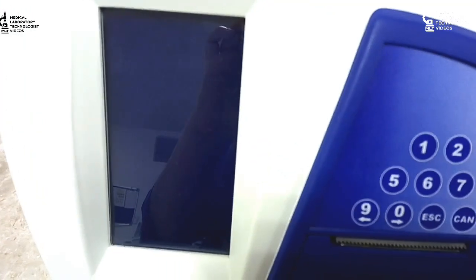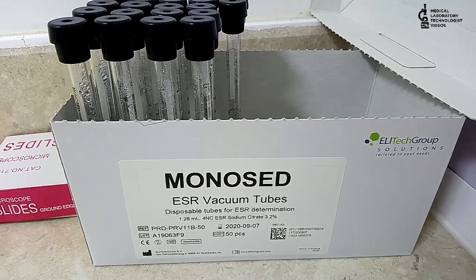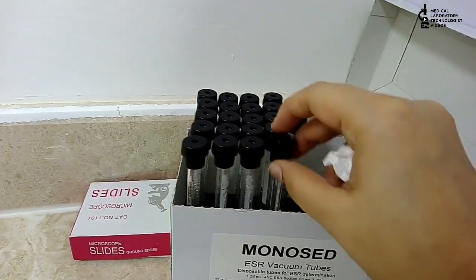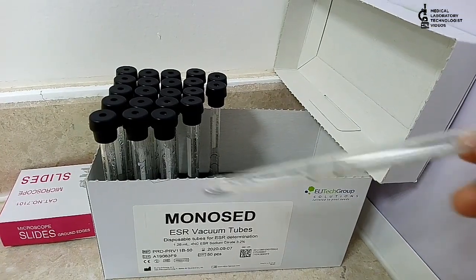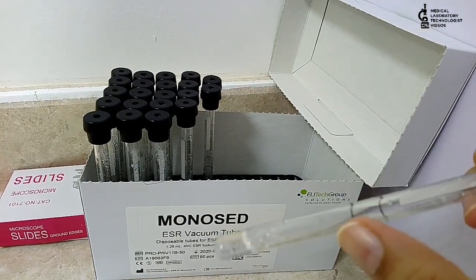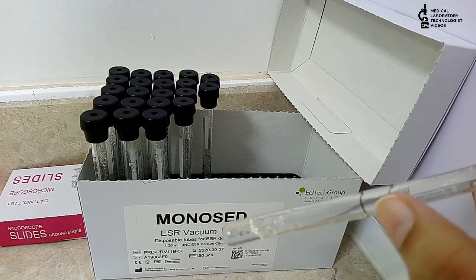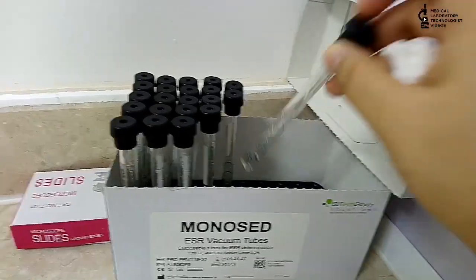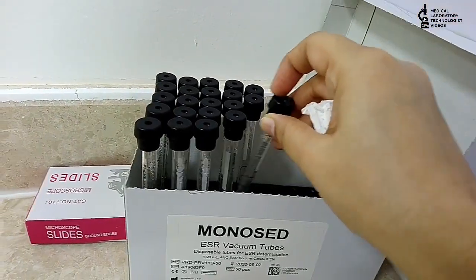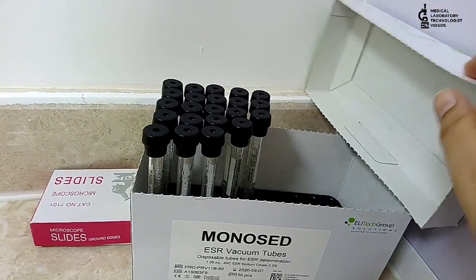At night time, if you are not using, you can shut down, otherwise you can keep it on. These are MonoSed ESR vacuum tubes that are available from the same company. You fill the blood until this mark, and sodium citrate is already available in this tube. You have to mix properly, and these tubes are kept at room temperature.